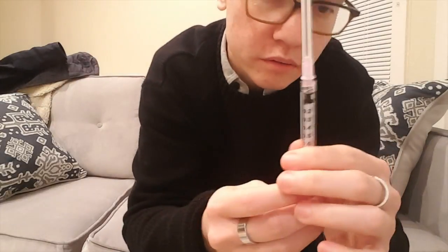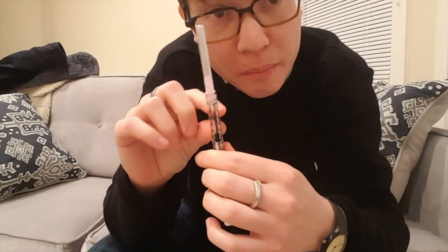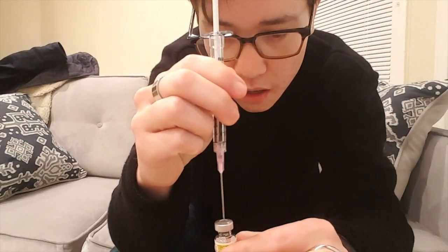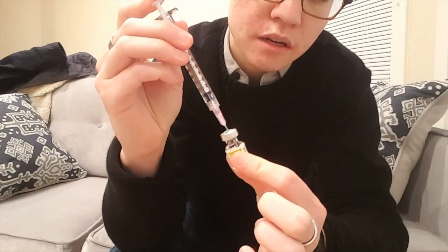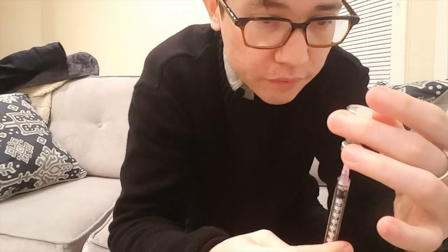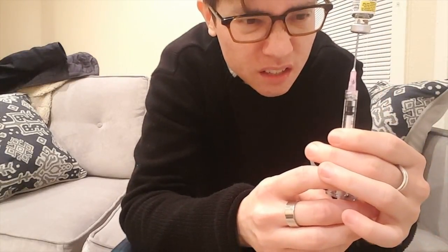Alright, I'm going to use about 0.4, so I'll draw a little, get air in there a little bit more than that. Alright, so this goes into this little top. Then push the air in. This exists as a little vacuum, so you put as much air in as you want to be able to draw stuff out. Hopefully this is enough for this shot. We'll see. Just draw it down.